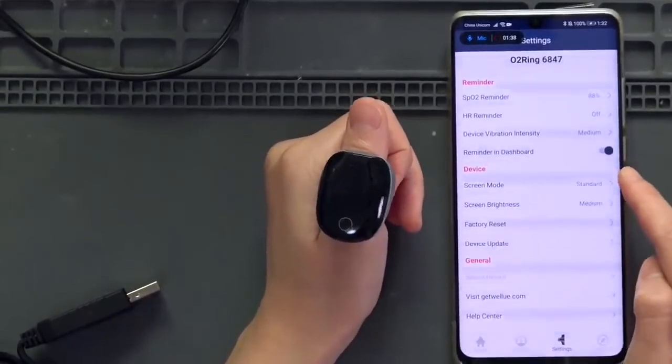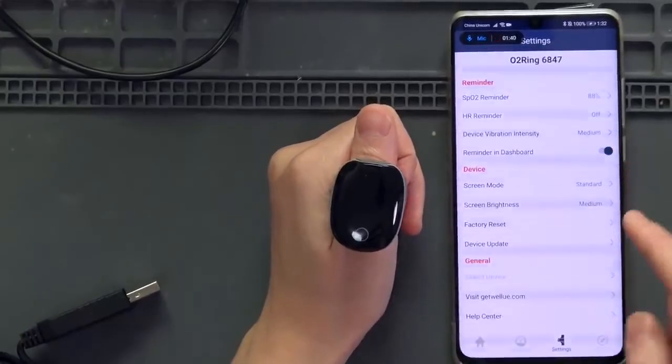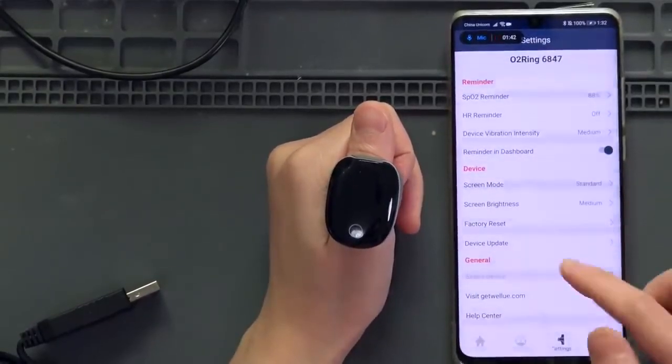Let me see — device vibration intensity is set to medium, and so on.